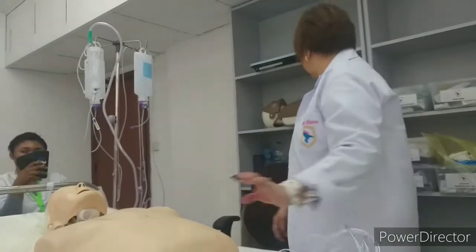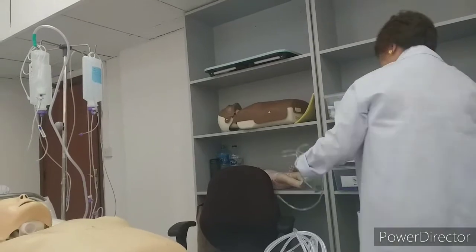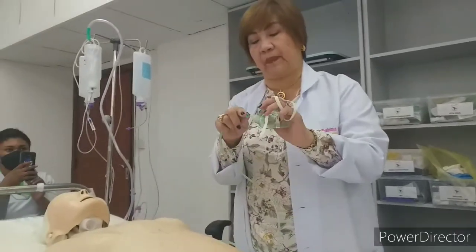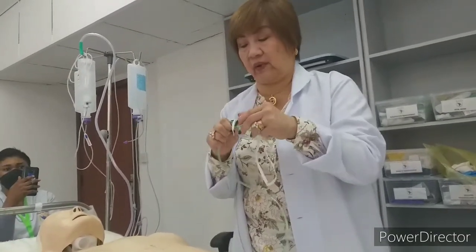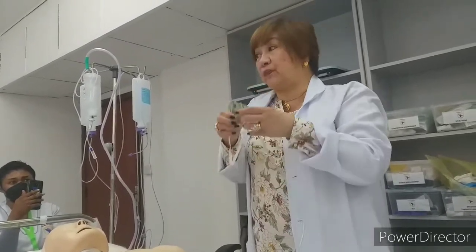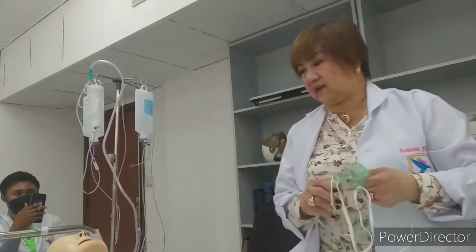The provision of oxygen to the patient who cannot breathe normally. Yes. Enable them to breathe. Providing oxygen to the patient. Why? To enable them to breathe normally. Okay, not normally because they are with disorder or something. Okay, so to provide oxygenation. Okay, so good airway, to provide good oxygenation, and what else?